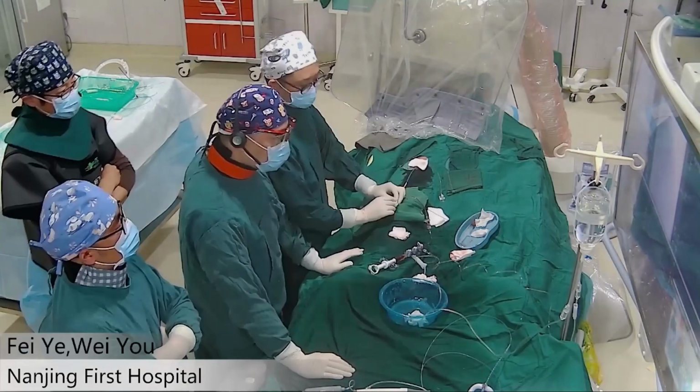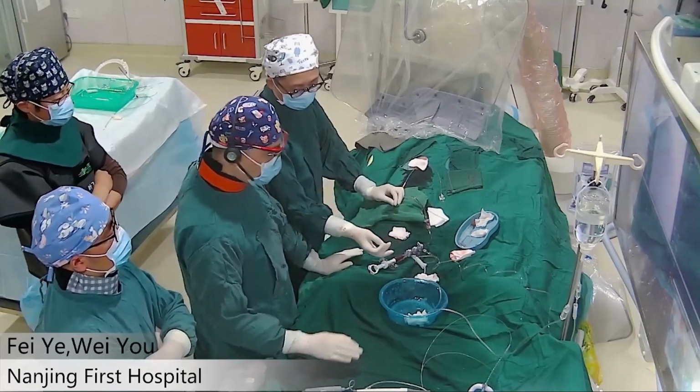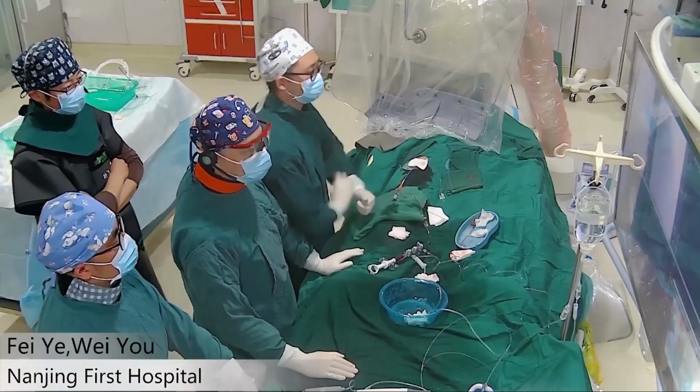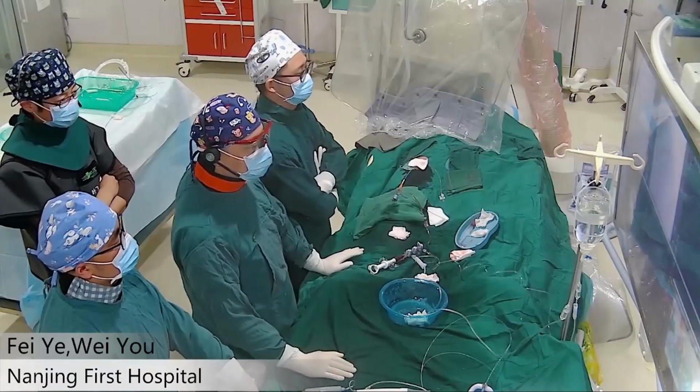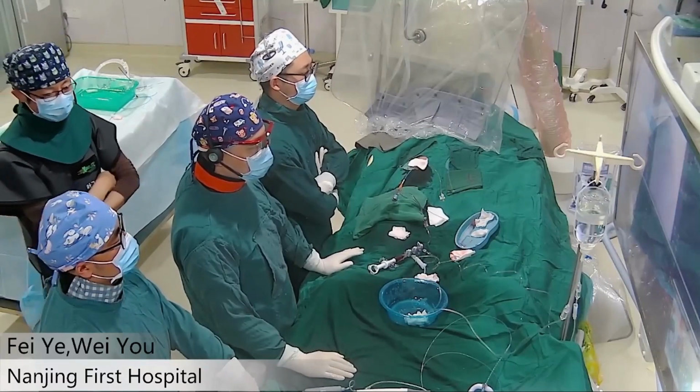Okay, we're ready. Step two from Nanjing First Hospital transmission. Today we will give another case about a complex bifurcation lesion, focusing on the diagonal and LAD. And I will introduce our colleagues to you.